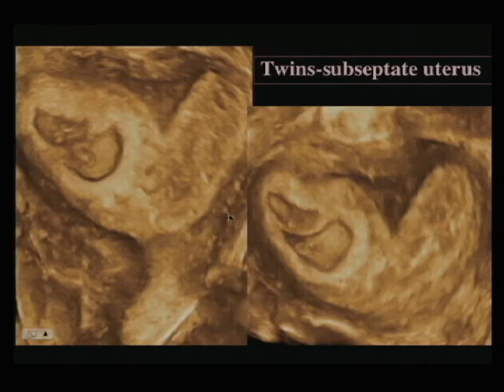And here is just one more case showing you a septate uterus right here, but what we have here is a twin pregnancy in one of the horns. This patient is at risk because she has a septum, which puts her at risk of miscarriage, and then on top of that she's also going to try to carry twins. So this is a very difficult pregnancy that probably requires a high-risk obstetrician to take care of.